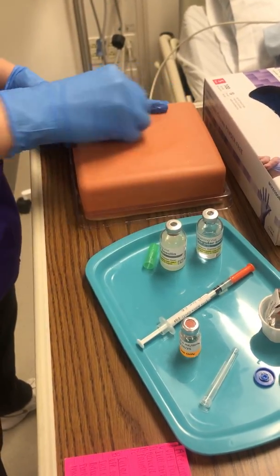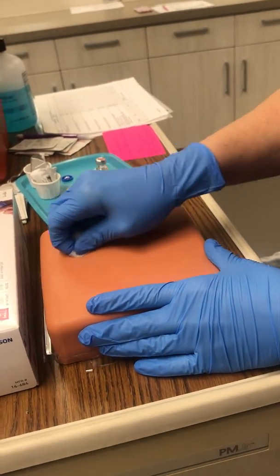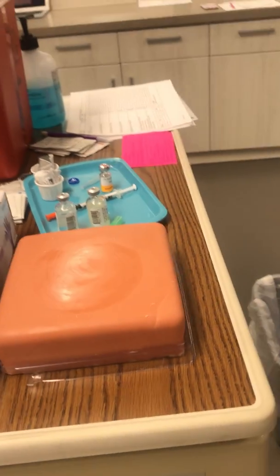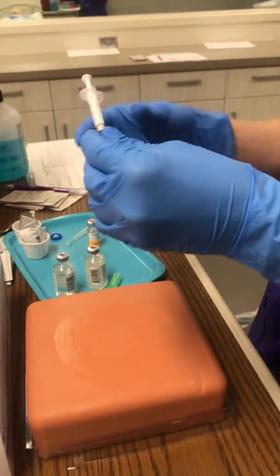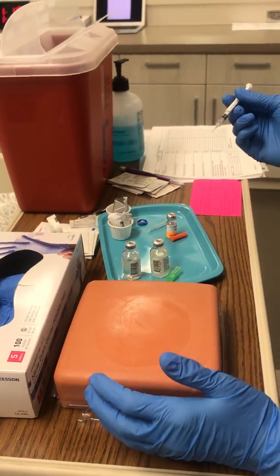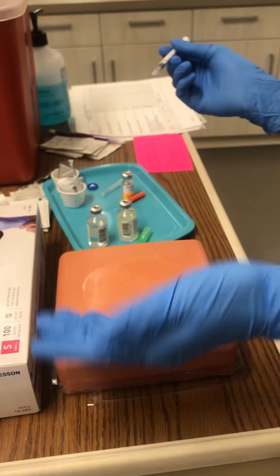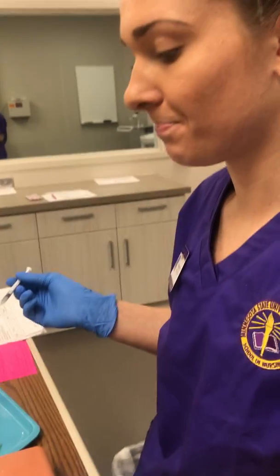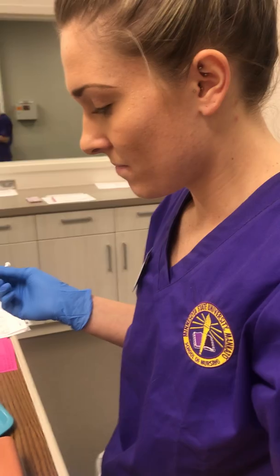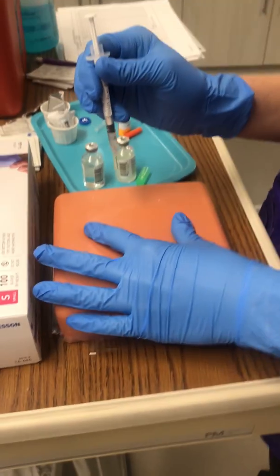Clean off really well. 2 inches or 5 centimeters there. Perfect. And then we'll take our cap, we'll pull it straight off, let that dry, and then just like we did on our last shot, we did a 90-degree angle, I just wanted to say, for the deltoid. And then this one, they have enough skin to do it, so we're gonna do a 90-degree angle on this one.